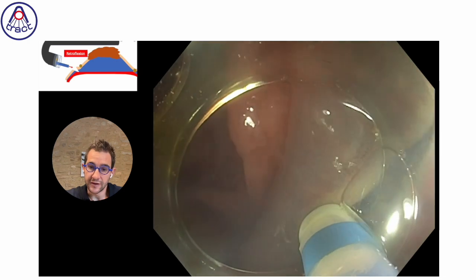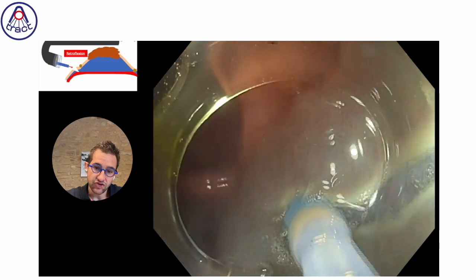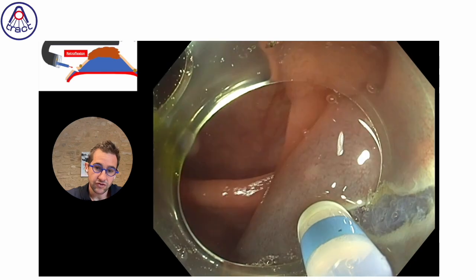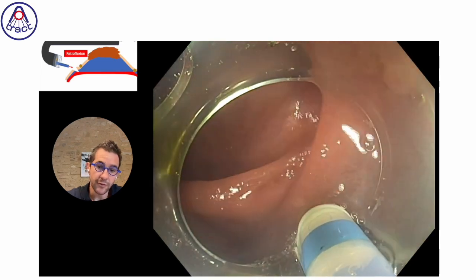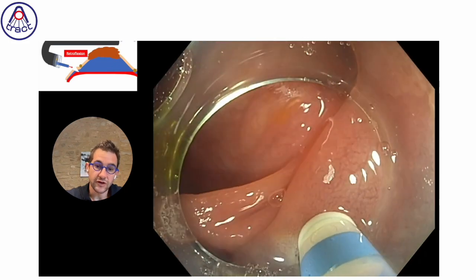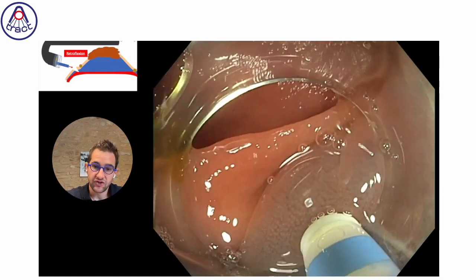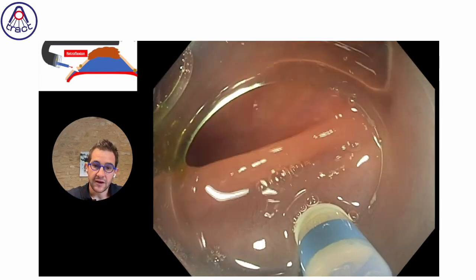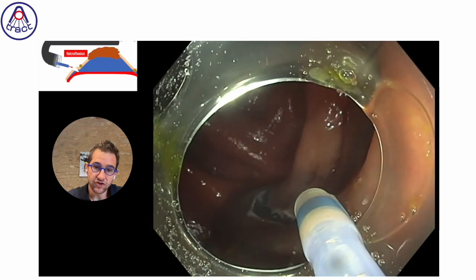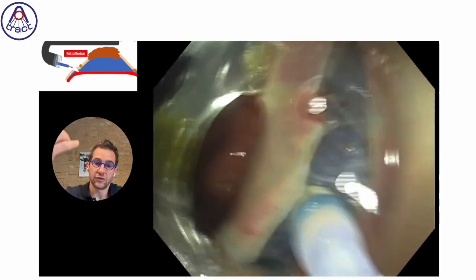And immediately after, I will increase my incision, doing a smile shape in retroflexion, trying to go to the top of the fold in order to make my direct approach easier afterwards. So we re-inject and re-inject through the knife, which is the Dual Knife J. And we inject and try to do the complete incision by retroflexion, trying to reach the top of the fold.